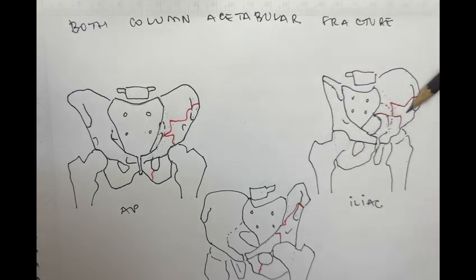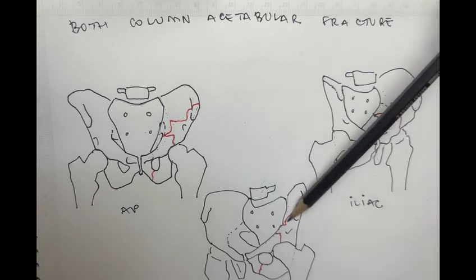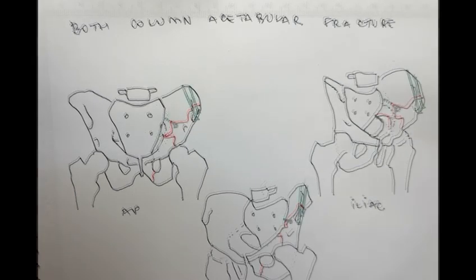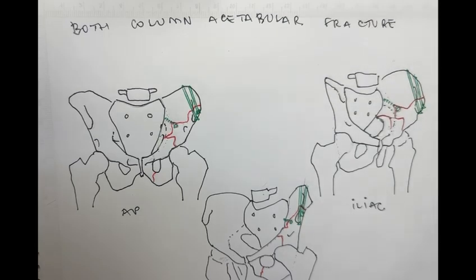And lastly, the posterior column will need to be reduced with some kind of technique, usually using some kind of clamps, like Matta clamps or something like that, and then fix the fracture with screws coming from the plate, or sometimes out of the plate, and trying to reach the posterior column. Sometimes the screws can come all the way down here, going to the ischium. So this is the first step of the fixation.